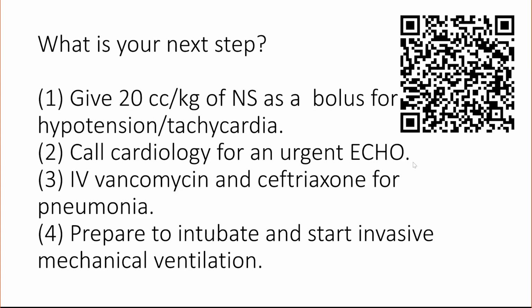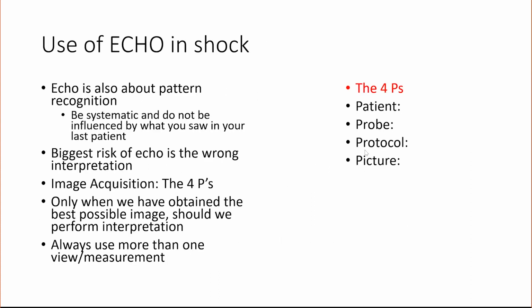I'll end this with just one slide on the use of echo in shock. Echo is all about pattern recognition. So when we do echo, it's always best to be very systematic. Do all the images, and do it the way it is done by a cardiologist.